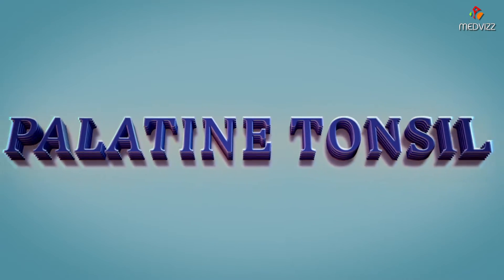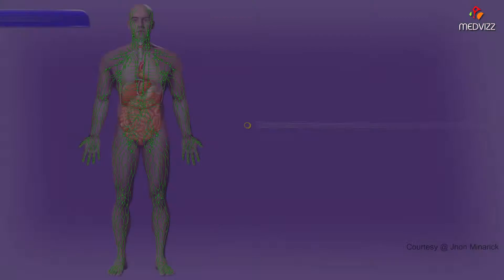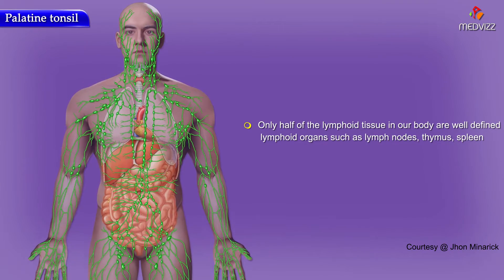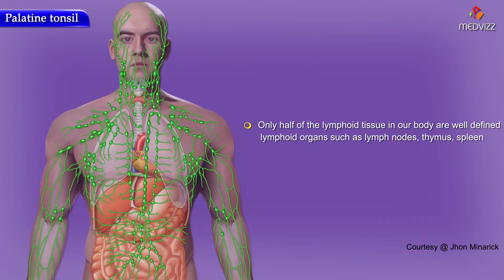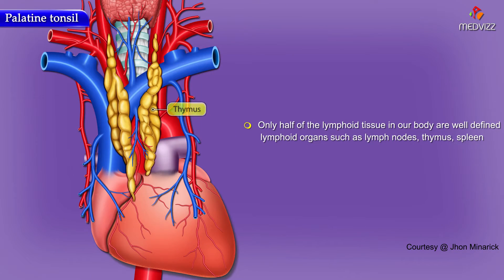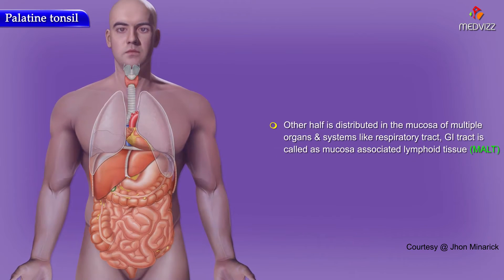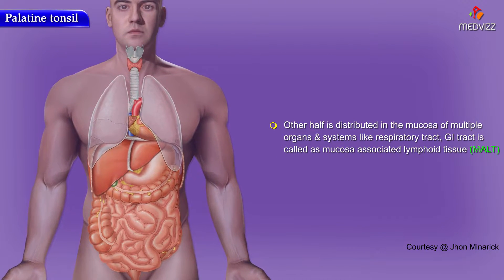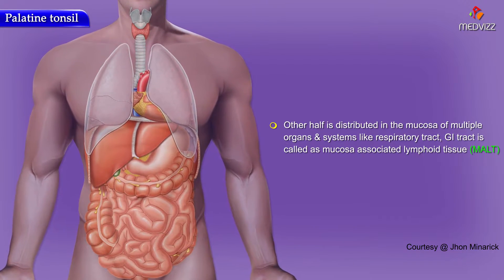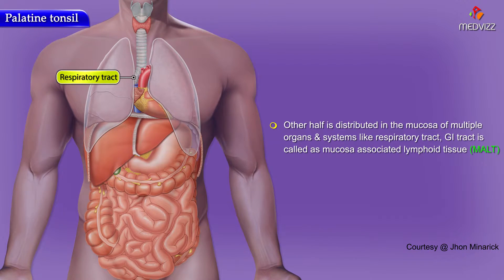This is a palatine tonsil. Only approximately half of the lymphoid tissue in your body is in well-defined lymphoid organs such as lymph nodes, thymus, and spleen. The other half is distributed in the mucosa of multiple organs and organ systems like the respiratory tract, GU tract, and gastrointestinal tract — this is called mucosal associated lymphoid tissue, or MALT.